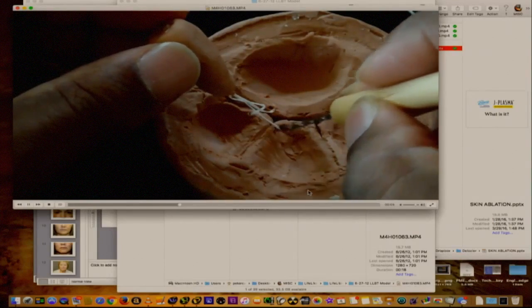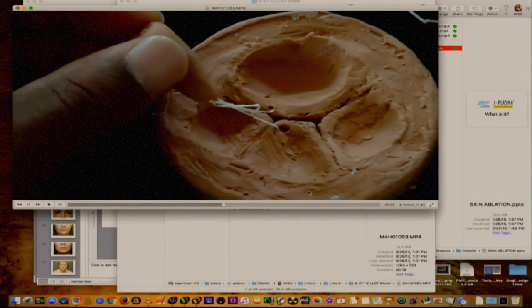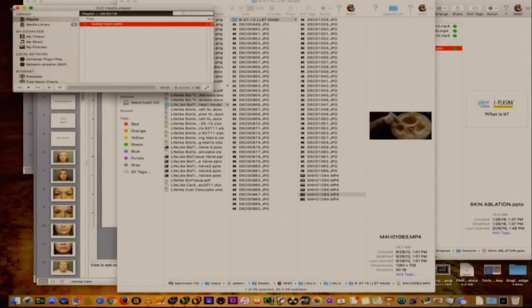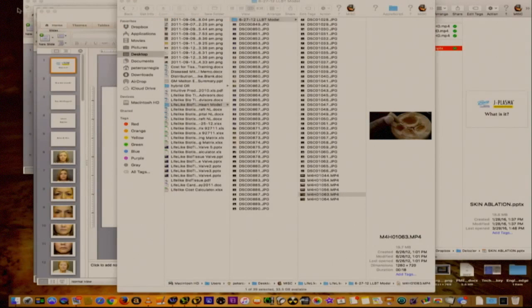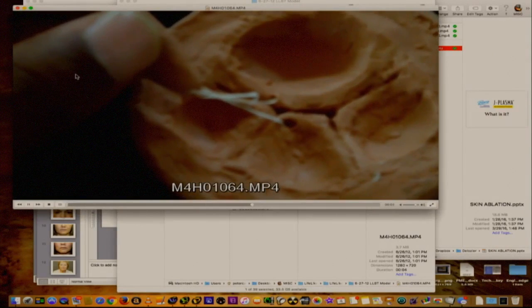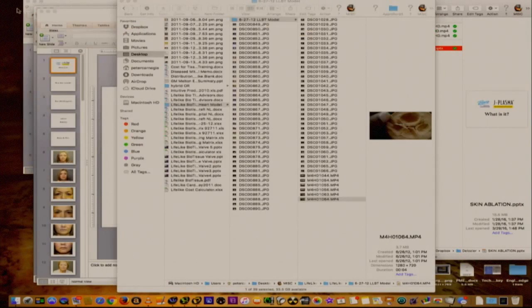So one of the things that we did as we were modeling this is figure out how do we place the cords, because the cords are of a denser material and they don't stretch as much, and they shouldn't. When they do stretch, it's usually permanently, and they elongate. So we looked at a couple of different models, and what we actually did use was suture. So we embedded suture into the LifeLike material, which is a lot more elastic, and that gave us a better replication of the human mitral valve model. And so it was very valuable for us to try different types of materials to make that happen. Let's see if I can locate that other video to show you.